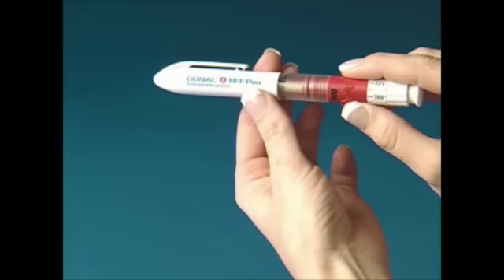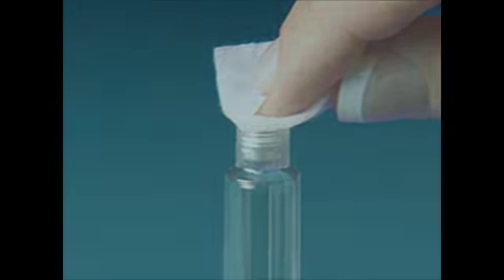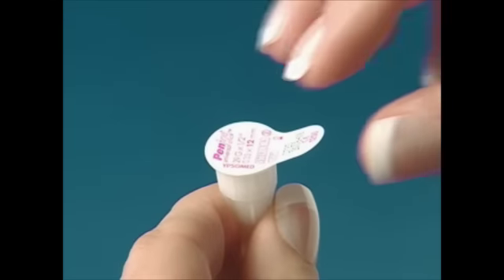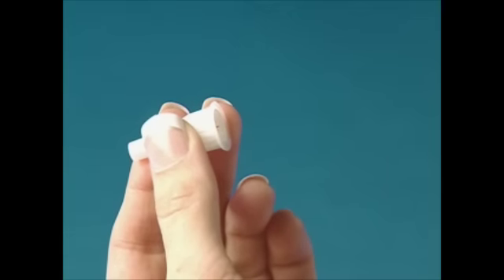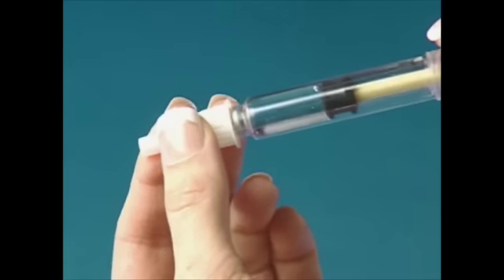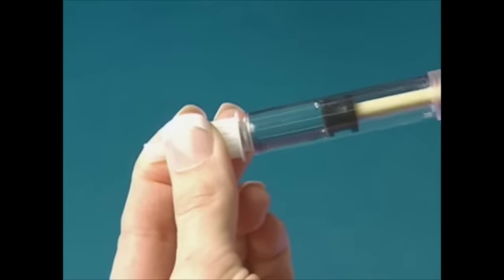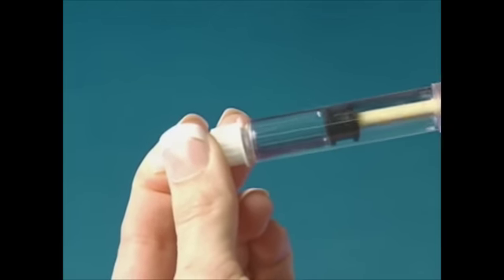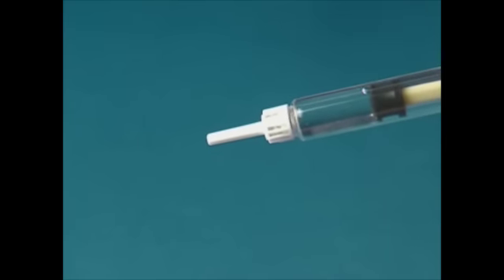Remove the pen cap. Wipe the threaded tip of the pen with an alcohol swab. Remove the peel tab from the outer needle cap. Hold the outer needle cap firmly in one hand and press the threaded tip of the pen into the open end of the outer needle cap. Twist the pen clockwise until the needle is securely attached. Remove the outer needle cap by gently pulling it straight off.